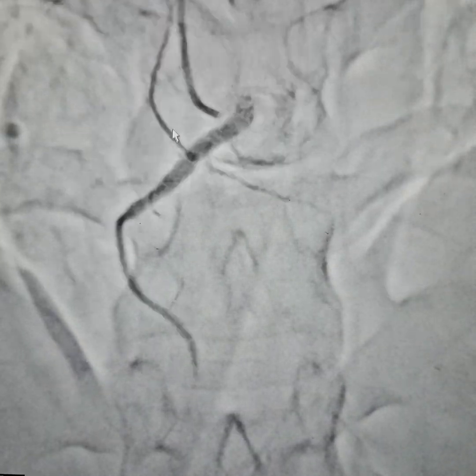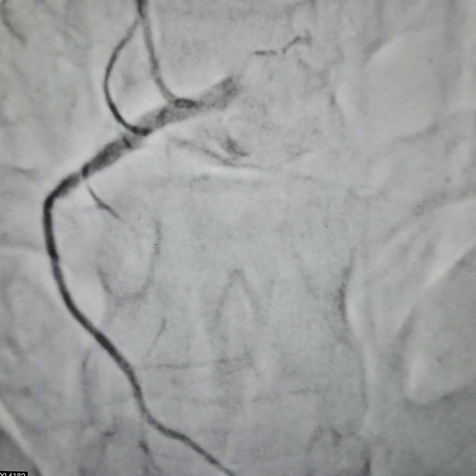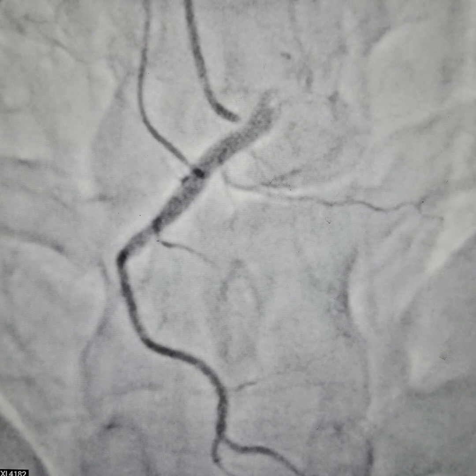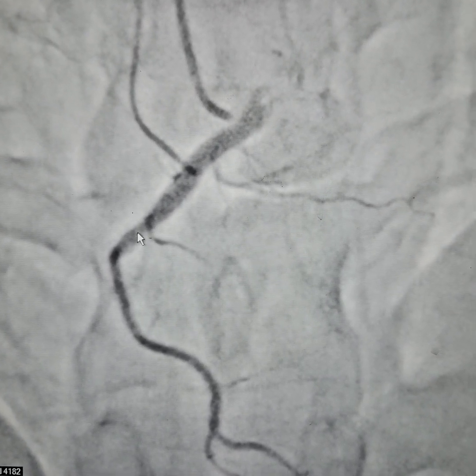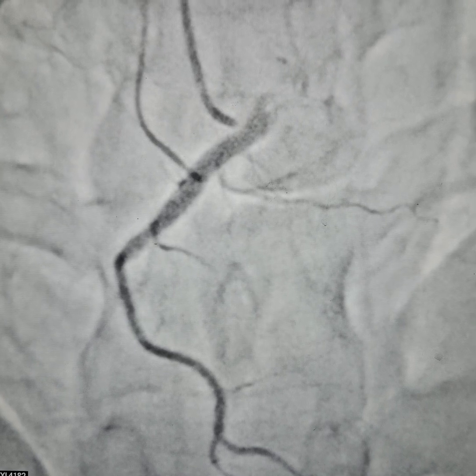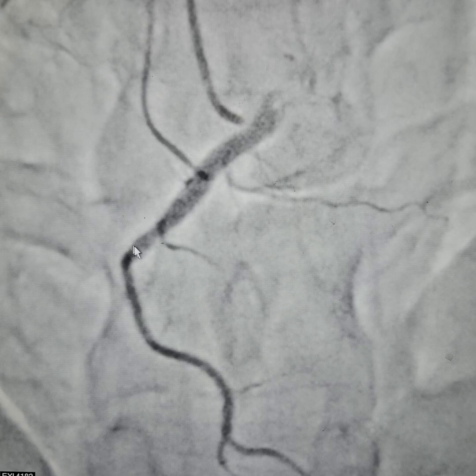We did another angiogram to see whether there was any stump or not that was present. However, the stump that we suspected was blunt. The stump would be somewhere here, but it is a blunt stump and the side branch is quite large at the adjacent side branch.